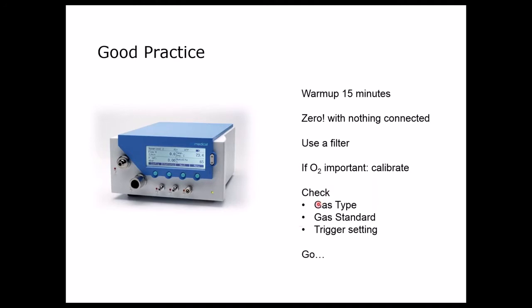Before we actually start working, we have to make sure that the gas type is set up correctly. We have to make sure the gas standard is set the same as the ventilator, and we want to make sure our trigger settings are working. The trigger settings can also be changed later on if anything seems strange or doesn't match up with the ventilator.